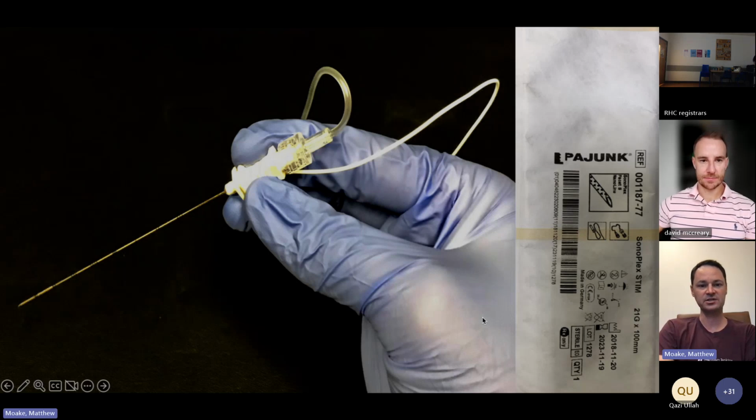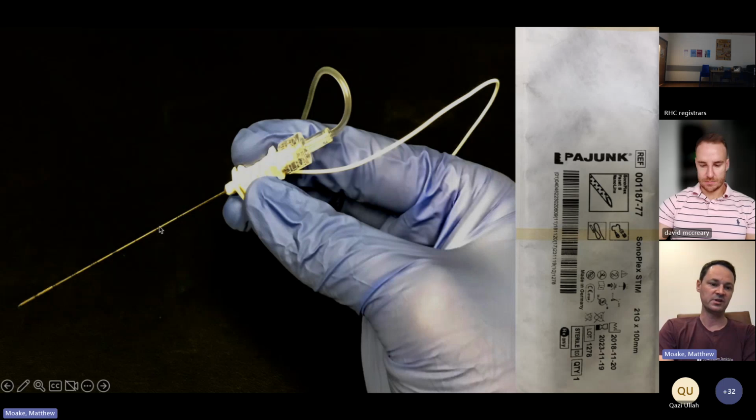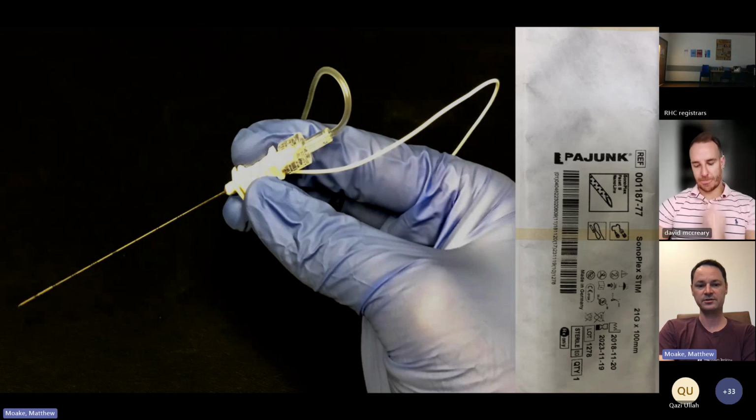Here's what that echogenic needle looks like. It's going to have a tube going to your syringe. In this case, this is a stimulating needle, so this goes to an electrical stimulator we can actually use for nerve stimulation. And as you run down the length of this needle, you can see these little black marks, which are depth markings. If you pay attention, particularly down here, you can see these little etches at the end of the needle. These are those laser etches that really help you show where your needle is on ultrasound.